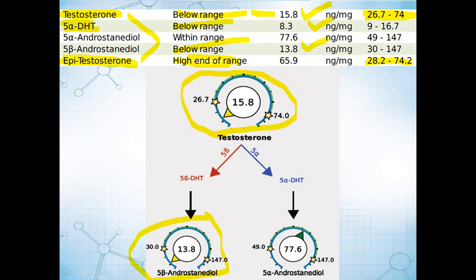Those are all going to be low even if you have plenty of hormones. So we have some internal checks that look for ratios of these, and we'll let providers know when this pattern is potentially there, because you should probably confirm with, I would suggest, a total and a free testosterone in blood to confirm what's going on with the testosterone.